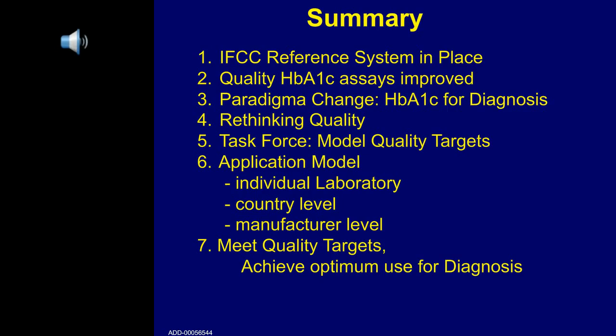There are point-of-care devices available. And as I have seen, and you could see in my presentation, some of them perform quite well. But there are also reports of systems that do not report well. And even when in the CAP survey you see that the performance of point of care is quite good, you should keep in mind that it can make quite a difference whether such a point-of-care instrument is operated by laboratory staff, as will be in the laboratories that participate in the CAP survey, or when it's operated in a doctor's office where people are less experienced with laboratory work and where it can be less good.